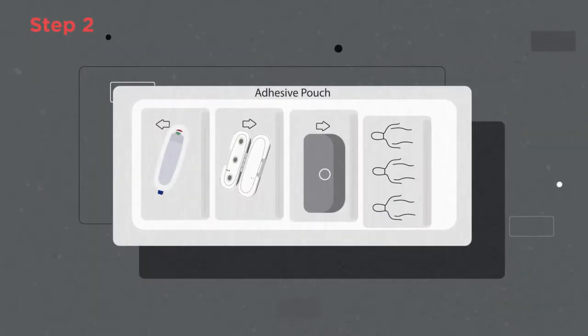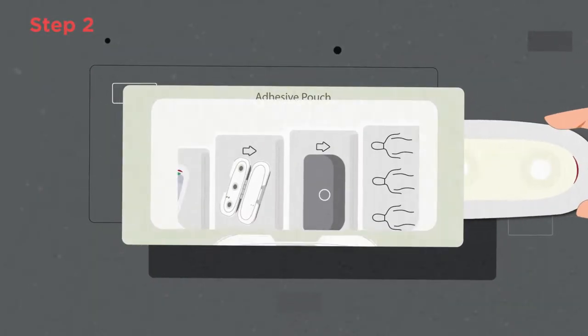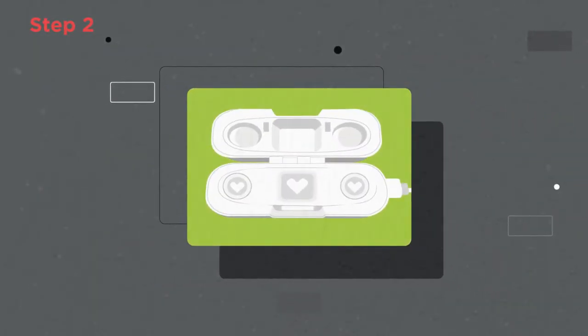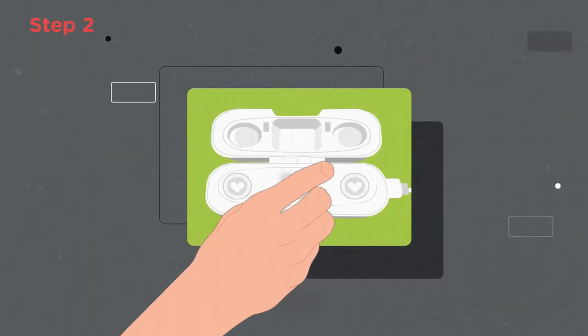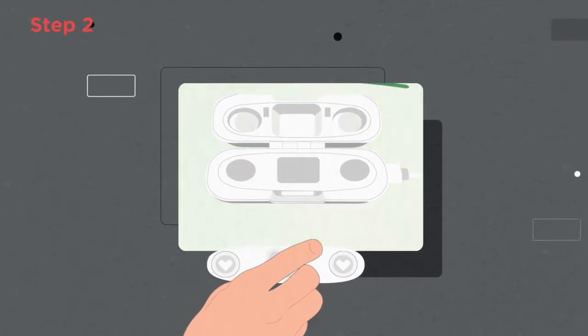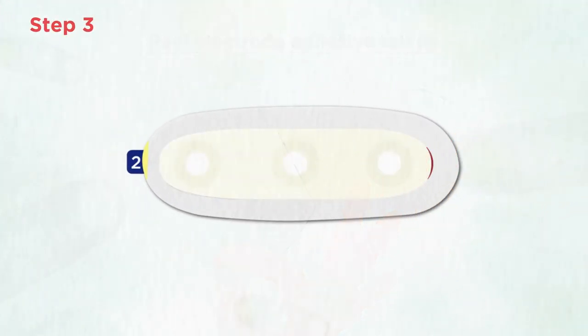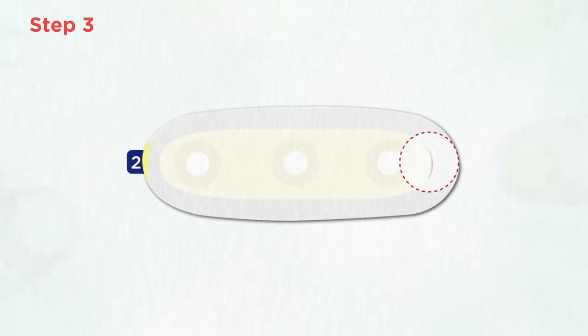Next, grab an adhesive from the pouch and remove the sensor from the charging case. Peel off the green tab labeled number one and place the sensor on the adhesive. Please be sure to leave the red tab exposed for easy removal later.